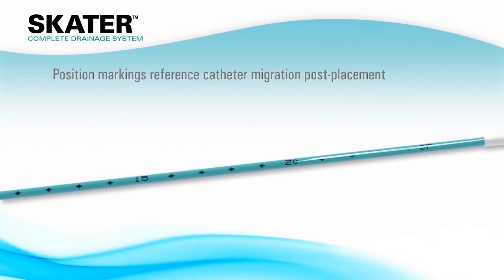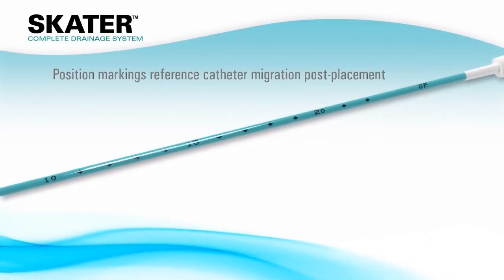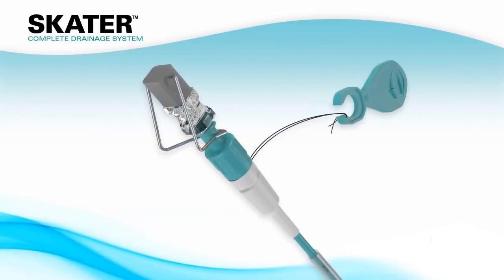The SKATER drainage catheters also include position markings that can be used to reference catheter migration post-placement.